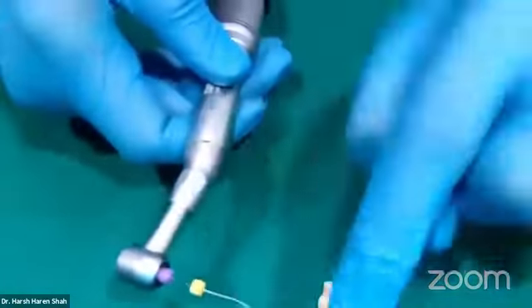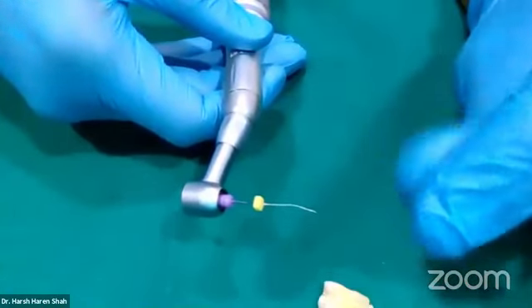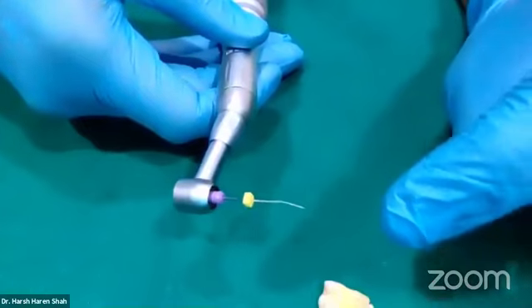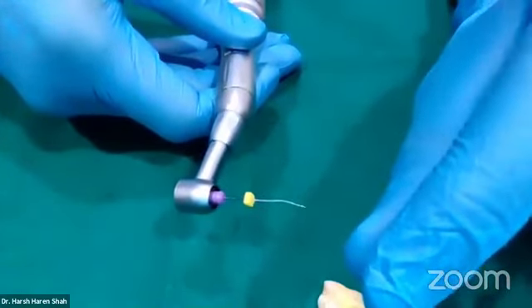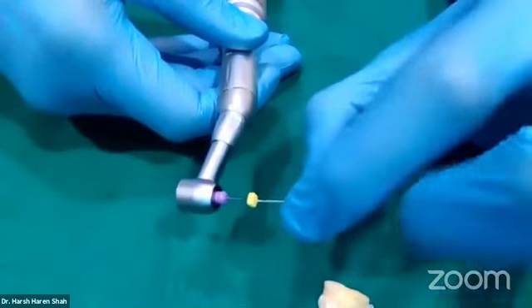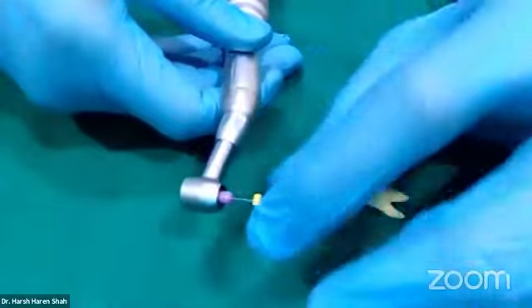Now, one advantage you can realize here is you are completing about 2000 cycles of watch winding per minute. With your fingers, you would be doing about 60 to 100 cycles a minute. So you are performing your entire glide path preparation at a speed of more than 20 times of what you would have done manually.